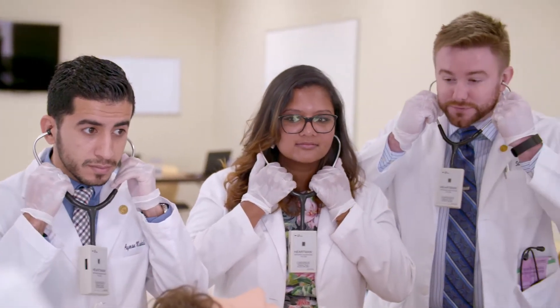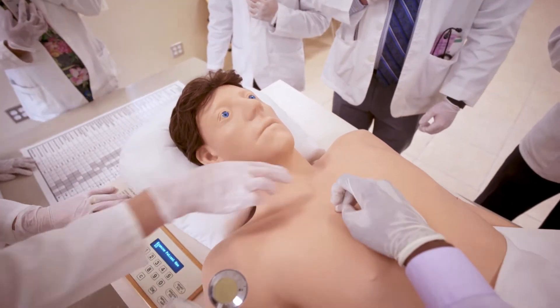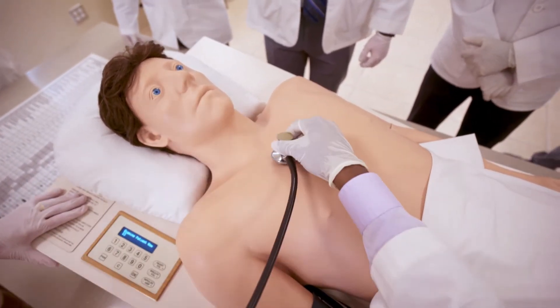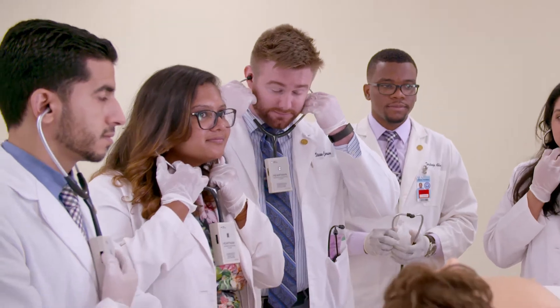So go ahead and have a listen and see if you can hear. You've got the controller. Locate the position. Here's your sternum. There's your sternal angle, and then just opposite that down a wee bit. So whenever you have your stethoscope on the patient's chest, you need to have your fingers on the carotid artery. Have a listen there and see if you can hear it radiating.